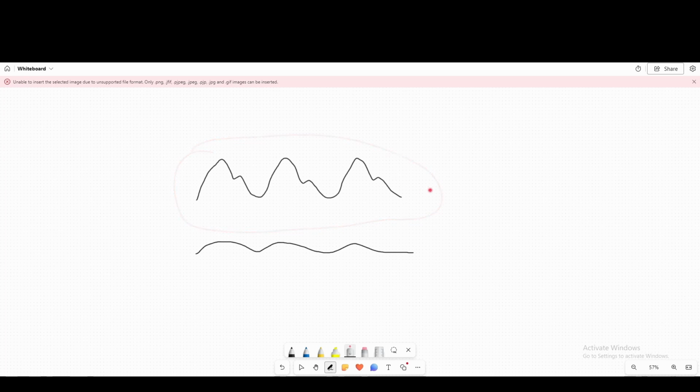What this is telling you on your actual saturation is a lot more reliable than this, right? And both of these are acceptable though, but if anything, it's saying that pulse oximeters are a relatively simple and oftentimes inaccurate tool, and it's just another reason to look at your patient in the context of your patient and use your tools as an addition to your assessment.